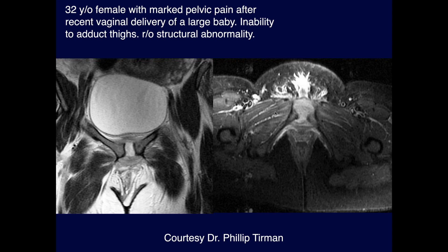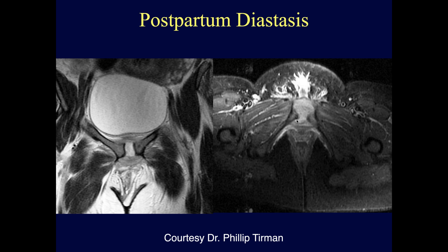A 32-year-old female with marked pelvic pain after recent vaginal delivery with inability to adduct. There is widening of the pubic symphysis and fluid signal intensity consistent with acute capsular injury of the pubic symphysis, along with edema within the bilateral adductor muscles. The acute widening and muscle edema suggest this is related to delivery rather than just pregnancy anatomy.